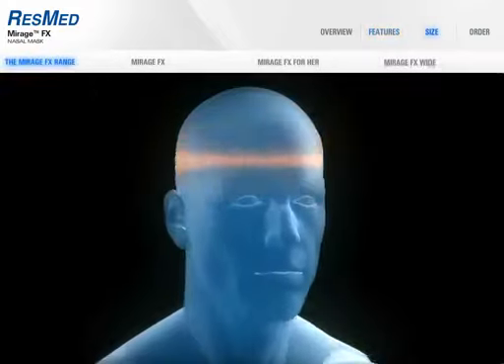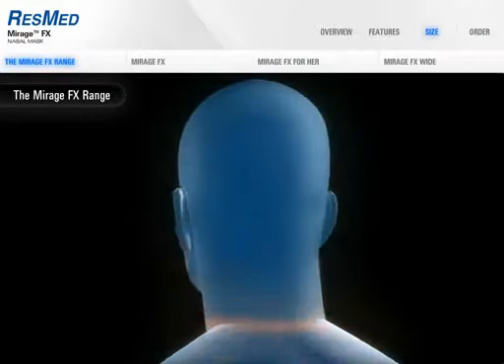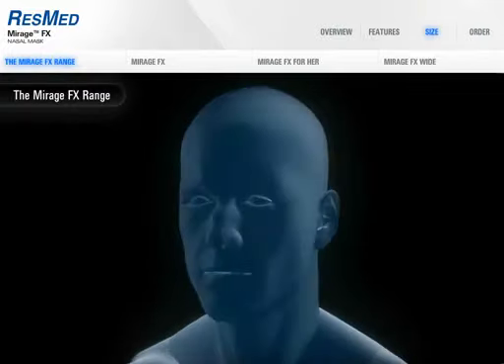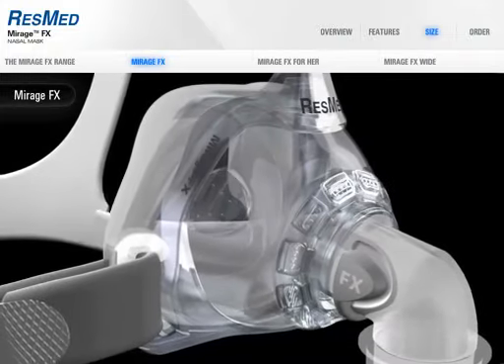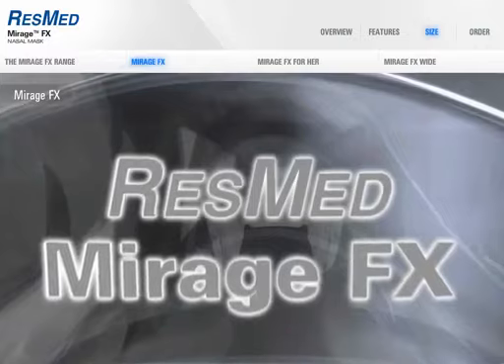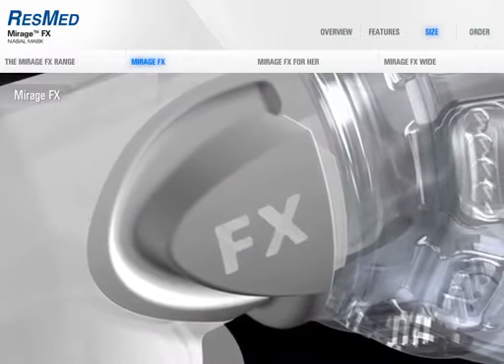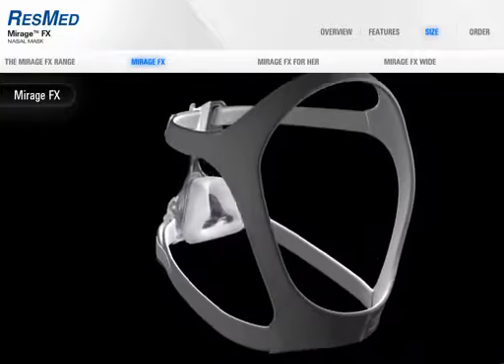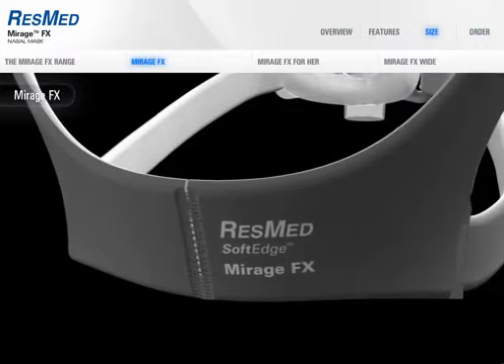The Mirage FX range of masks means there is a solution for everybody. The standard size comfortably fits a remarkable 9 out of 10 people. Mirage FX comes with the standard size cushion, standard size frame, the squeeze tab elbow, and ResMed's new soft edge headgear. You'll be amazed at the range of patients you can comfortably fit with this compact and unobtrusive mask.